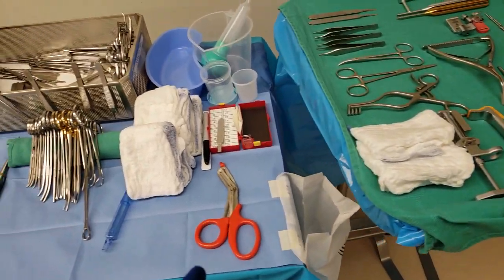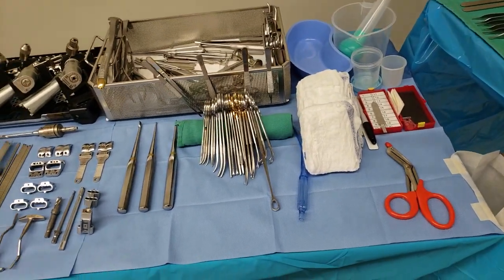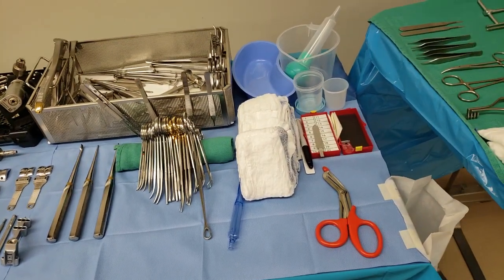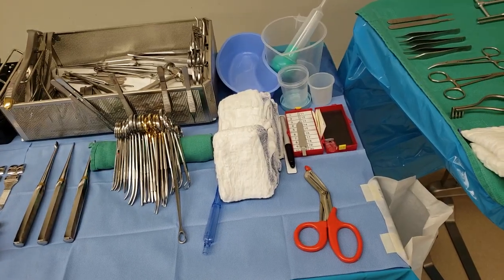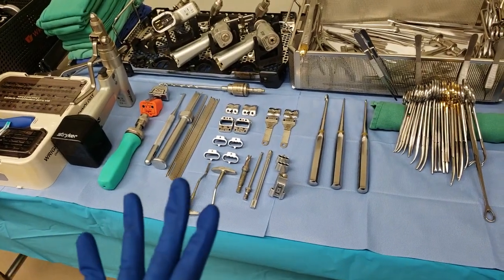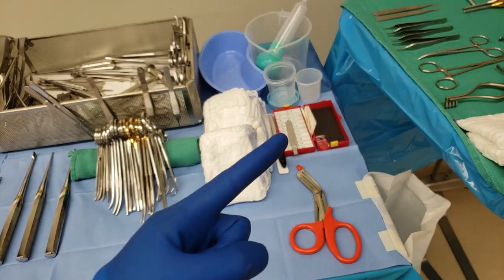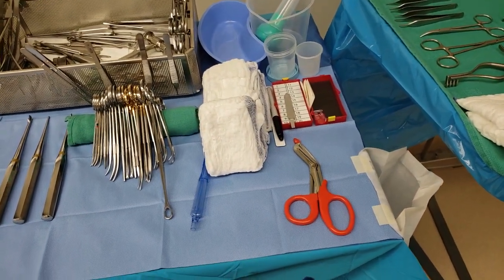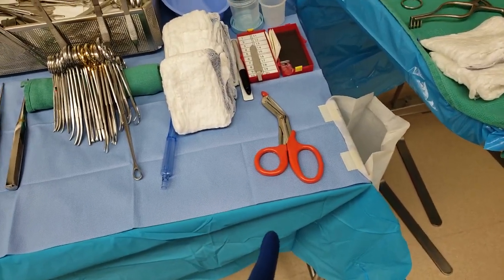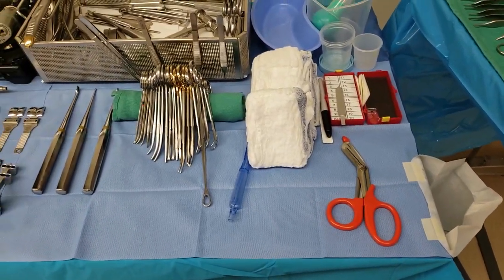2 laps. And as you can see, this isn't my normal setup. It varies, especially in orthopedic, and when you're trying to consolidate your space, you kind of have to minimize the little space that you have to maximize it, to provide space for the important stuff. So I usually have that red thing over here, but I don't. That's just me, just for space. And I usually have the trash over here, but because the residents move around a lot, they snag it, so I just put it on the side.